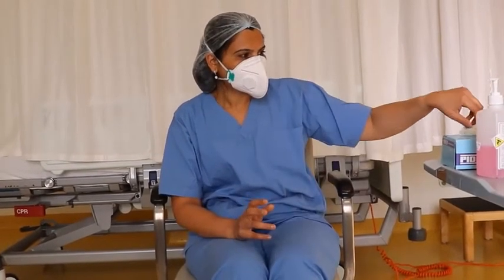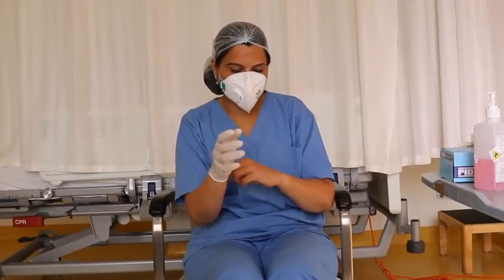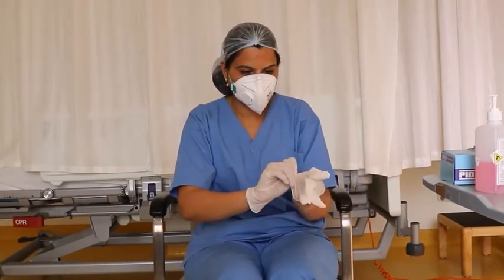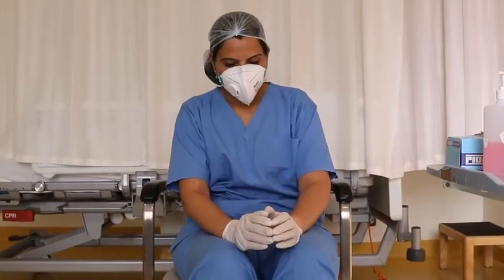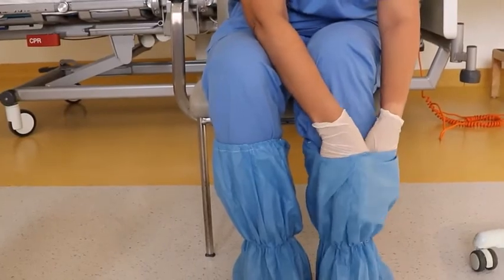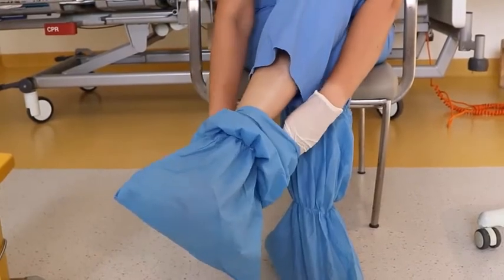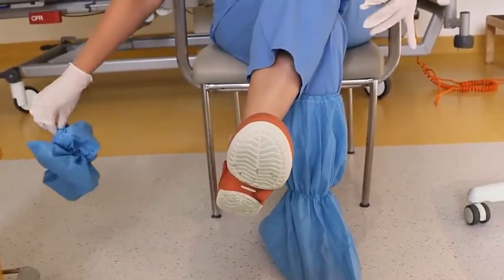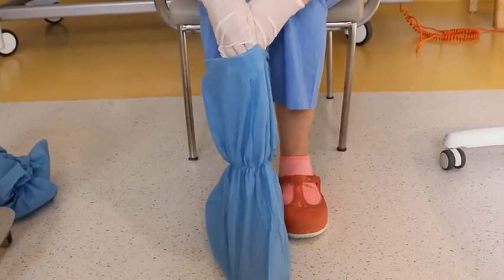To remove the shoe cover, put on clean gloves again. Place your hand inside the shoe cover and slowly peel the shoe cover off, making sure you do not touch the outer part. Using the glove-in-glove technique, repeat this process to remove the second shoe cover.